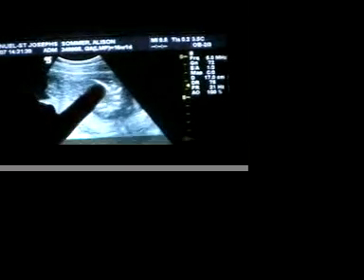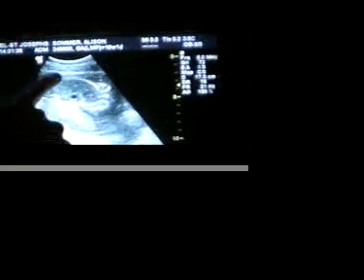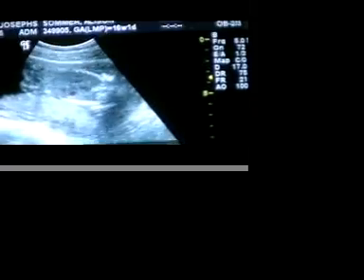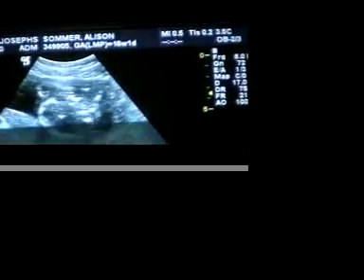There's her heart again there. You can see her little ribs there? As she gets older, these are going to get more calcified and harder. The ultrasound beams won't be able to shoot through them, so you'll be able to see shadows beneath them. But right now they're more like collagenous or cartilage. And so we can see past them easily. But you'll notice that as we get further along in pregnancy.